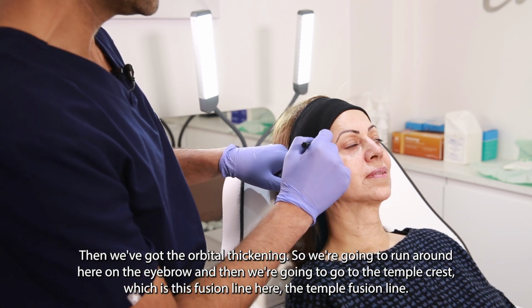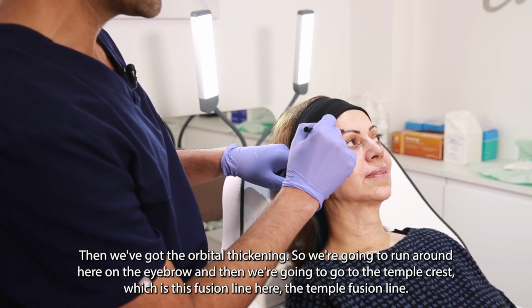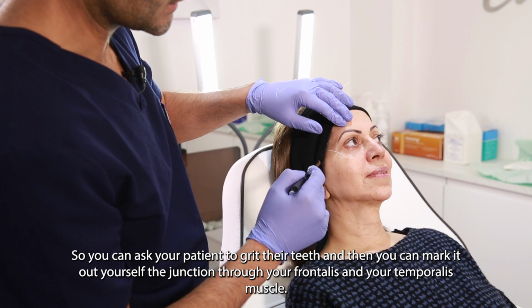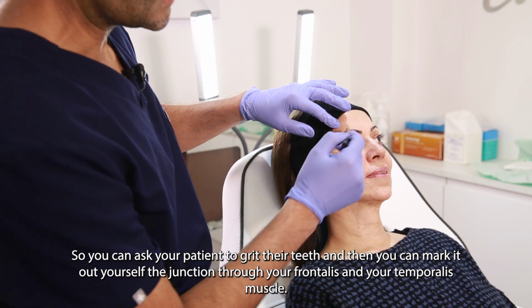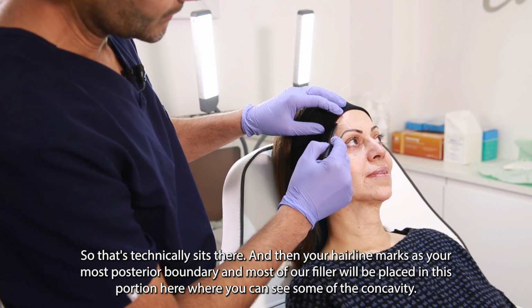Then we've got the orbital thickening. So we're going to run around here, around the eyebrow. And then we're going to go to the temple crest, which is this fusion line here, the temporal fusion line. So you can ask your patient to kind of grit their teeth, and then you can mark it out yourself, the junction between your frontalis and your temporalis muscle. So that typically sits there. And then your hairline marks as your most posterior boundary.